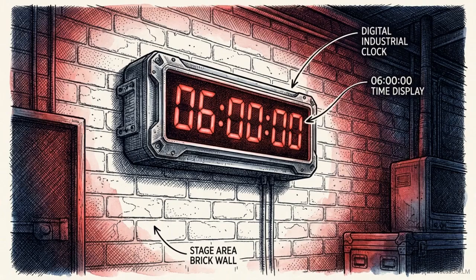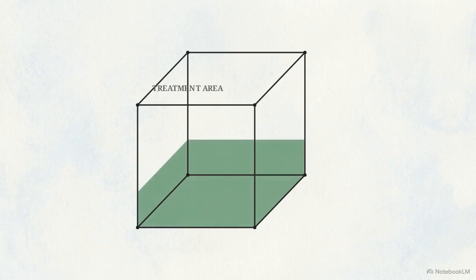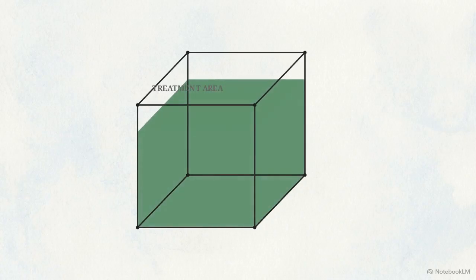With the room sealed, the required contact time begins. This waiting period ranges from 3 to 10 hours, depending on your industry's specific validation standards. The gas actively expands to fill the environment, reaching absolute saturation.